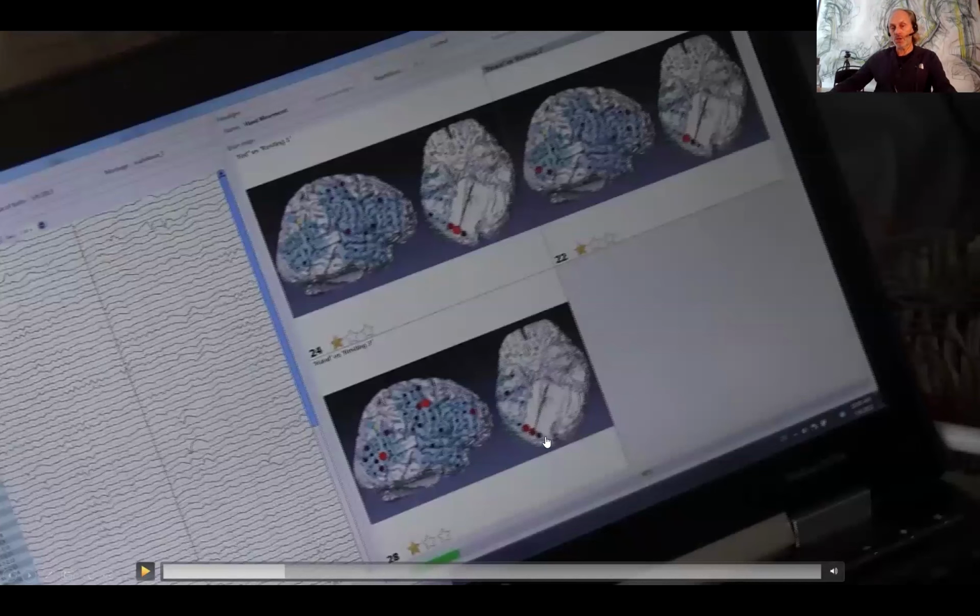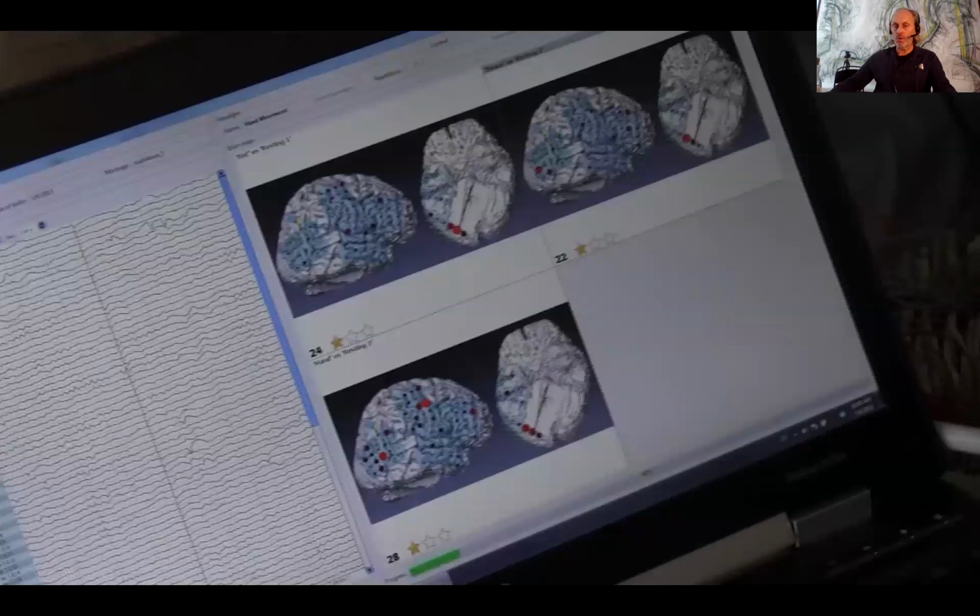But at this time, we just didn't understand what the bubbles here mean. So we thought this must be an artifact on these few electrodes that we had inserted here. And later on, we figured out that this is actually the shape and color sensitive region and also the face sensitive region of the brain. And people at this time just didn't know the meaning of these red bubbles. So nowadays we are doing a lot of research to investigate the temporal base. And you will hear more about these experiments.